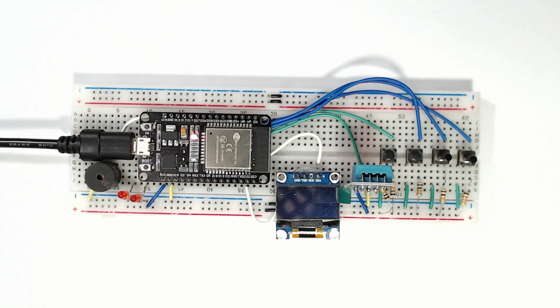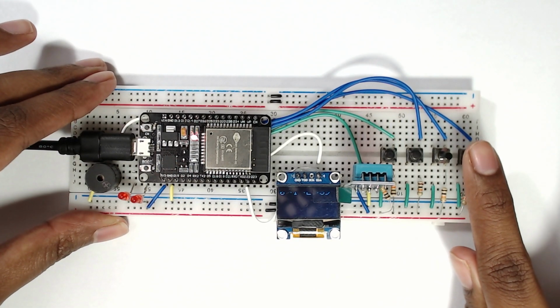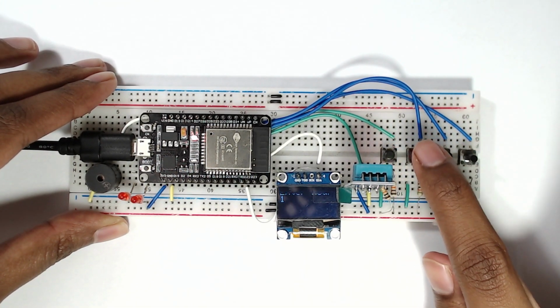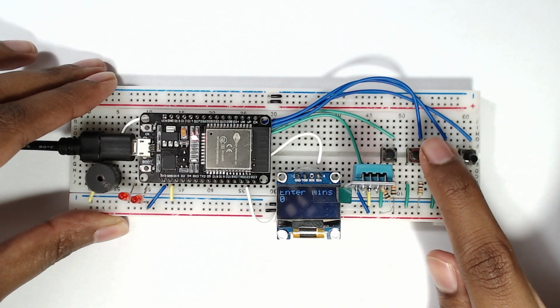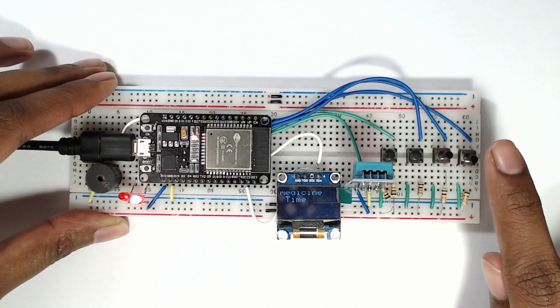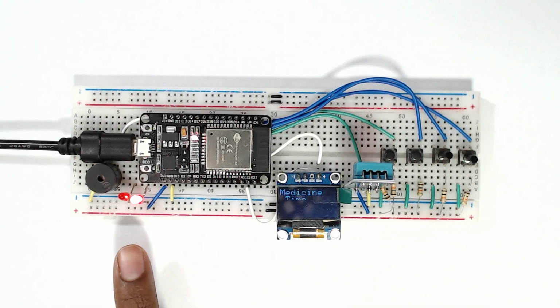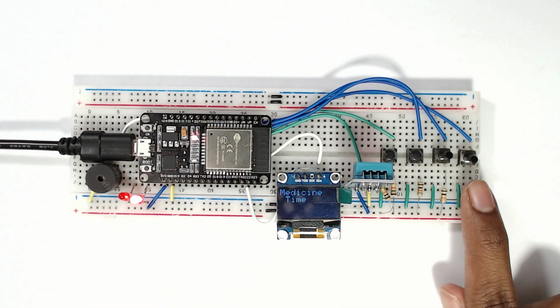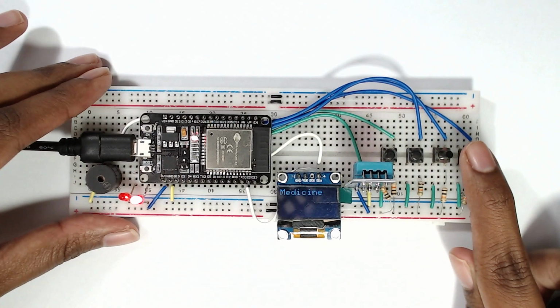Now the time is 1:02. I will try setting an alarm to 1:03 and see if the alarm rings properly. Now the alarm is ringing. The LED has lighted up, and even if you can't hear it, the buzzer is emitting some sound. And you can see the message on the OLED as well. To disable the alarm, I will press the cancel push button once.